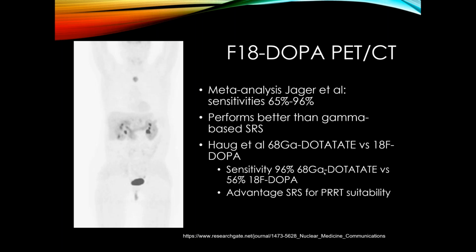Just one study showed that DOTA-TATE still is more sensitive than the F18 DOPA PET. And again, this F18 DOPA still is not able to assess for PRRT suitability.